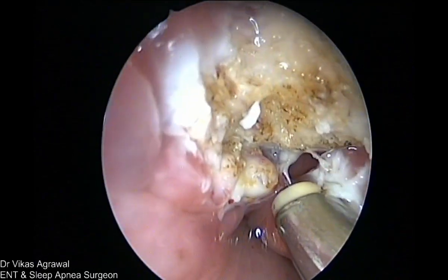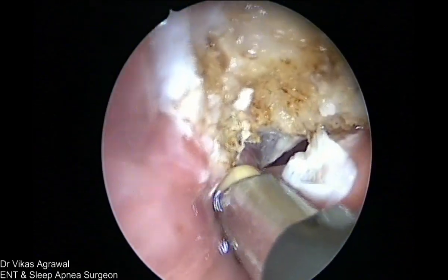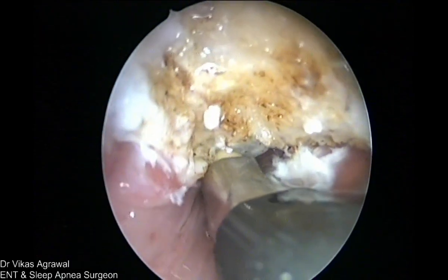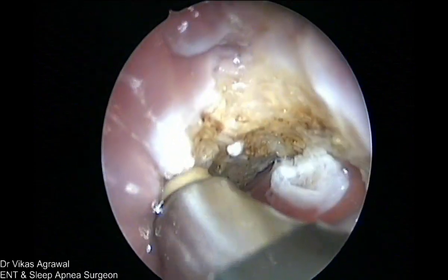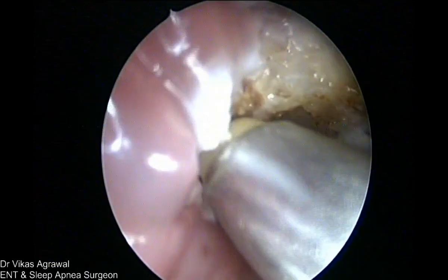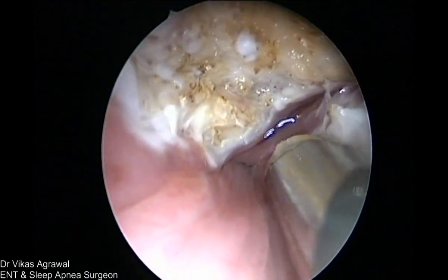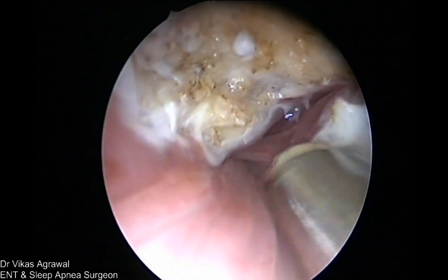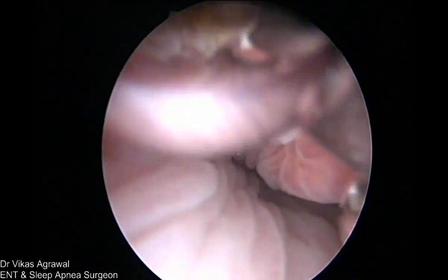See the midline, can you see that? This is the lateral part. Lateral part really doesn't cause so much airway blockage. Laterally, all the vessels come from the lateral side, and the problem is in the midline. So why would you want to ablate laterally? You can only coagulate laterally, so there will be no bleeding. See this, now this mucosa is redundant. So what I am doing is only coagulating this mucosa.